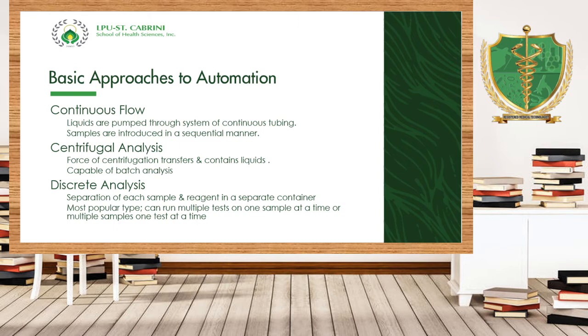Next in line is the centrifugal analyzer or centrifugal analysis. The force of centrifugation transfers the liquid and contains it. Take note that centrifugal analyzers use cuvettes, and one of the major advantages is batch analysis. Next is the discrete analysis, which is the separation of each sample and reagent in a separate container.